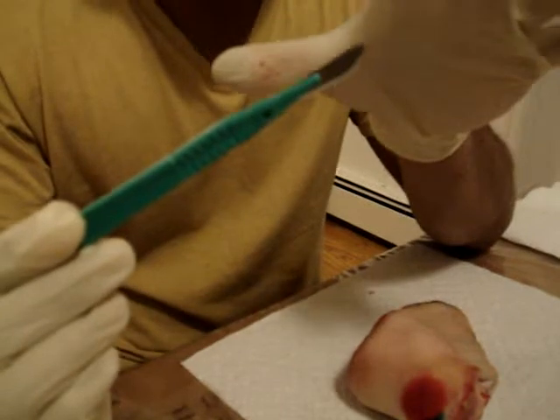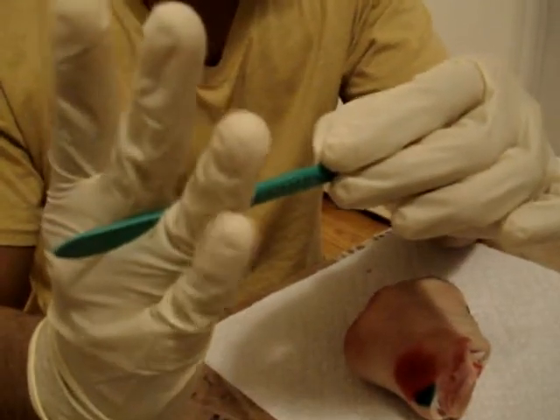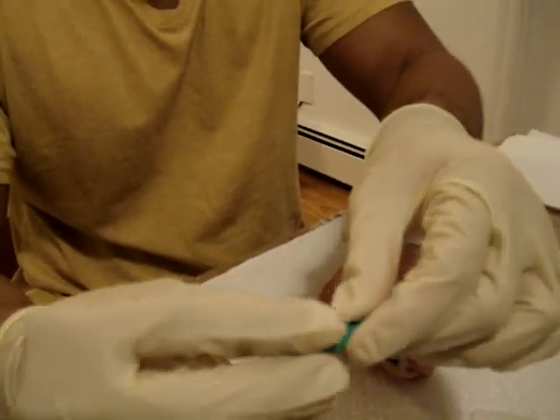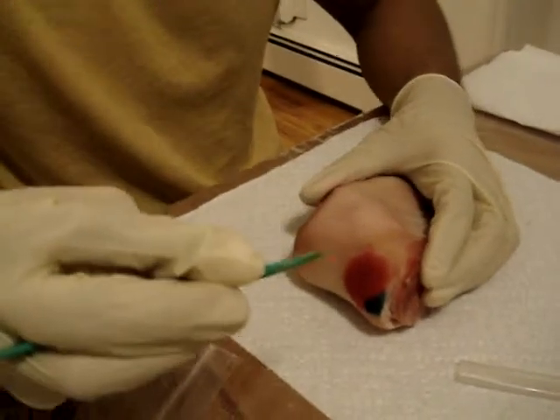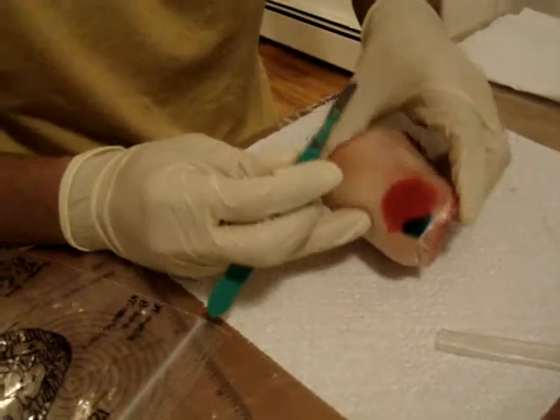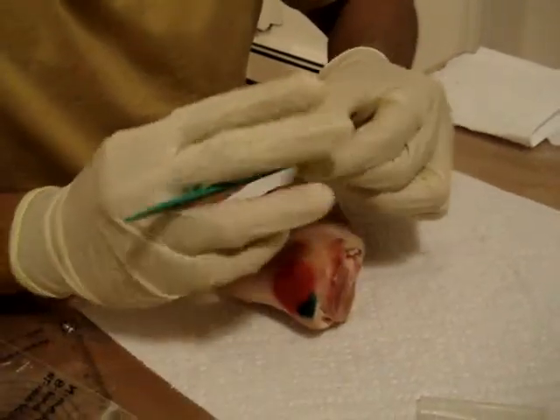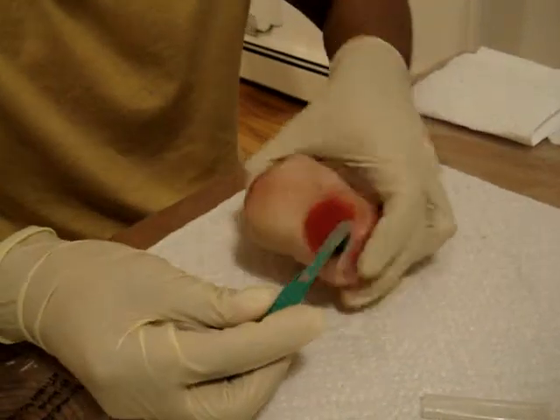And the way we hold it is that we put it in between the ring finger and the middle finger, or the third web space. And then we wrap around our distal tips of the fingers here on the serrated part of the blade. And then making sure that we firmly grasp that serrated part. So we begin to stabilize this ham hock using our non-dominant side for added stability. And what we do is we begin, repeating it again, on the third web space, holding it firmly.